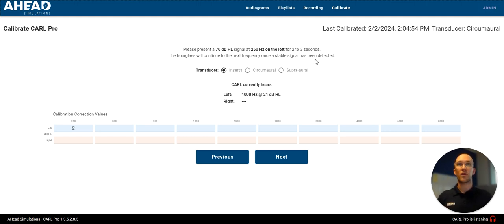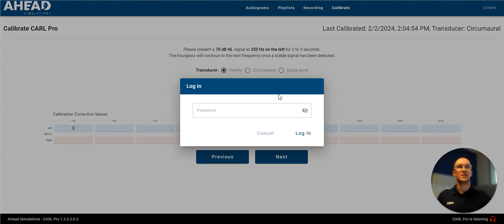Number four is going to be creating your own audiogram. So for that, we're going to go into the admin portal.